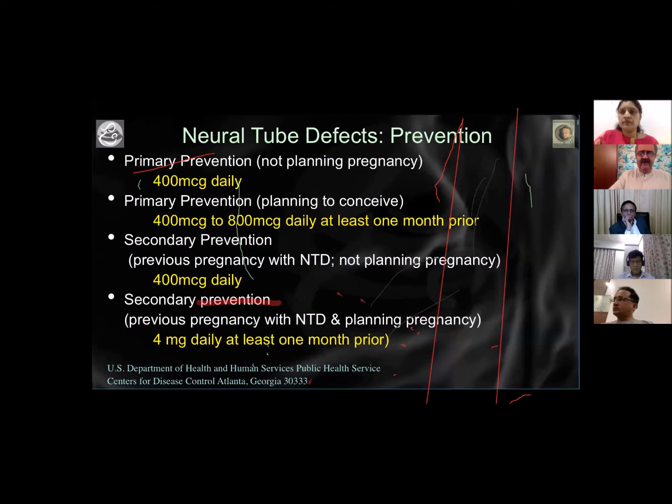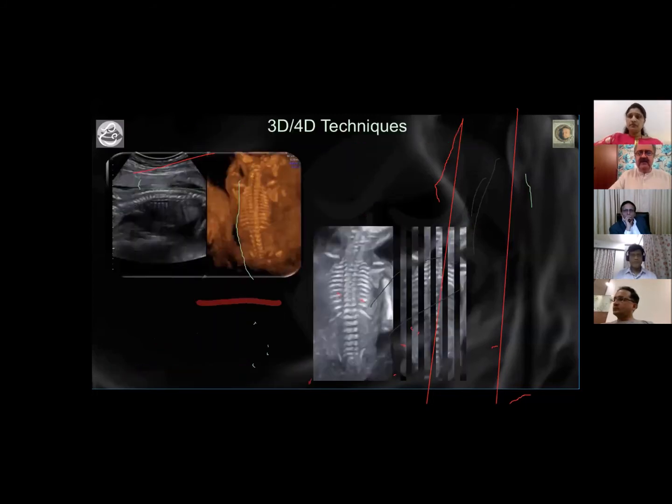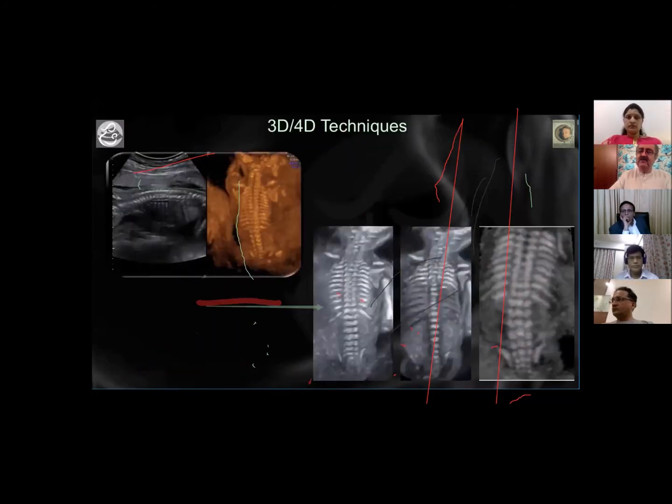Now, remember that 3D and 4D are not primary techniques, but they're additional techniques, and therefore it is worth actually looking at them, and seeing whether they might give more information.